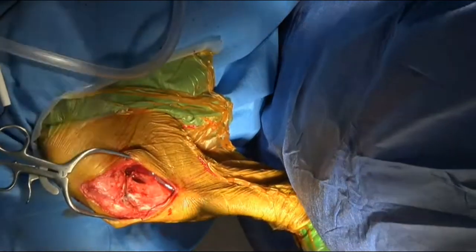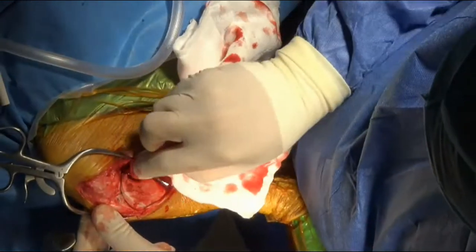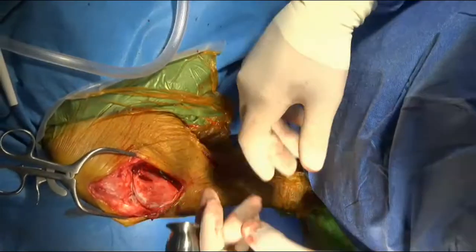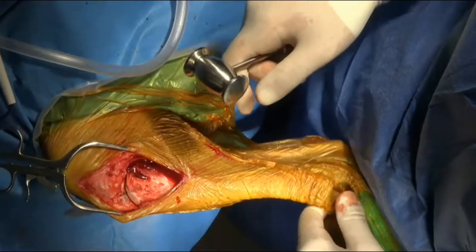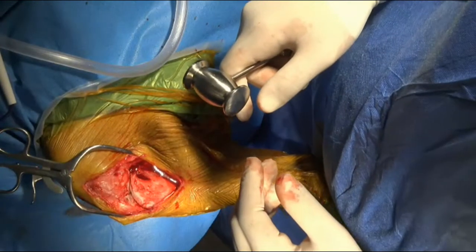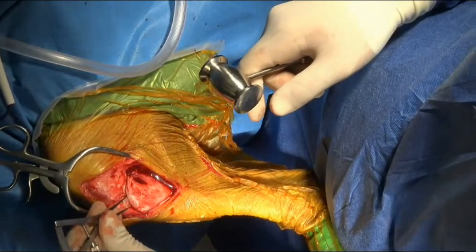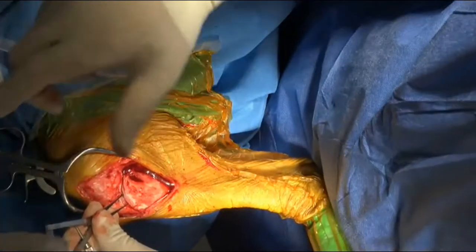What did you say? Yes, 9. No, I put 2.2. Let's go 9.5. Thank you. So just putting our second mark on the osteotomy here.